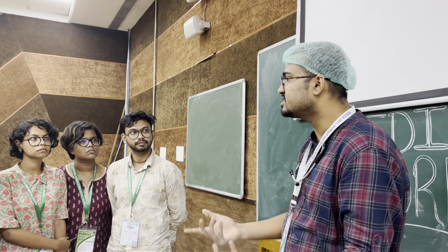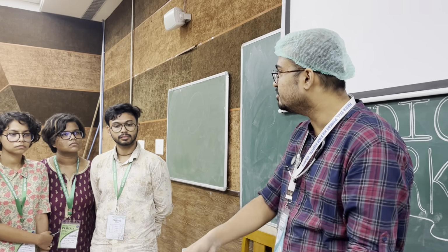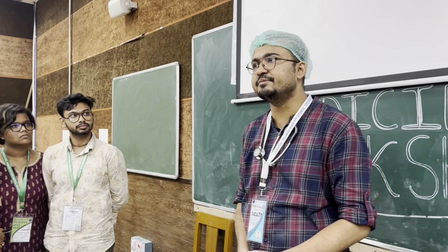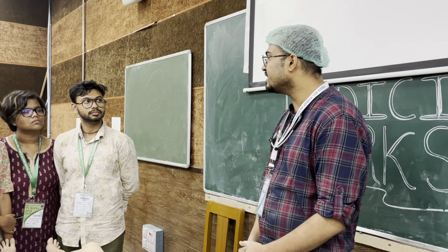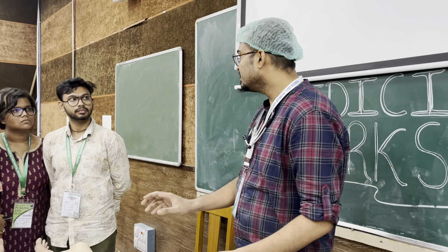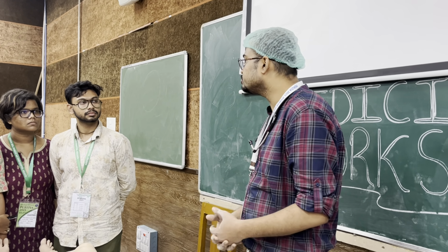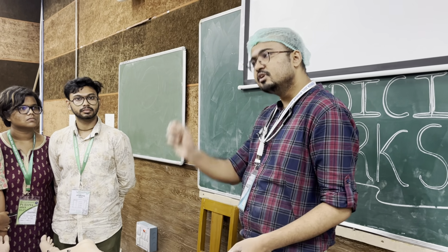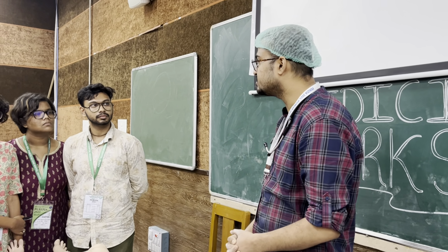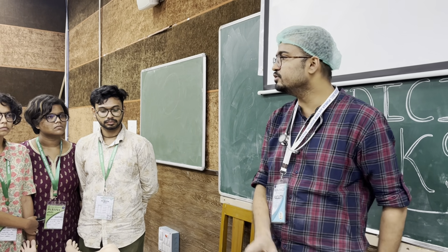Another is any poisoning. To take out the unabsorbed poison, we will introduce the tube and suck out the material. But it should not be any corrosives, alkali or acid. In that case, if done early, it is okay, but we cannot introduce it after a while. Why? There is necrosis or corrosion of the gastric wall. If you push it, it will penetrate the gastric wall. There will be perforation. So in case of corrosive poisoning, you should not introduce this tube.